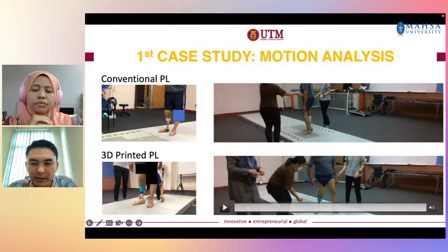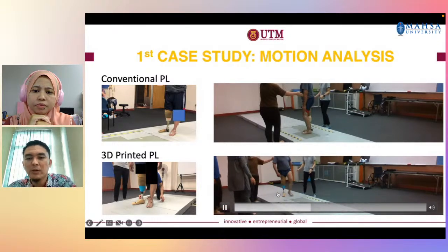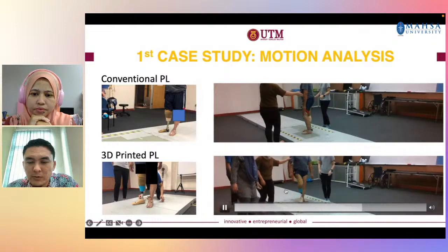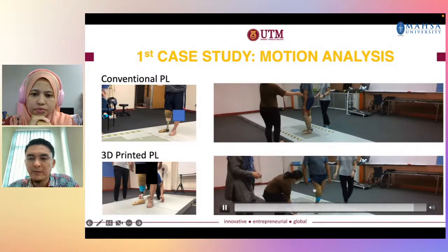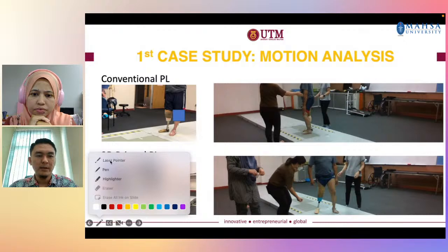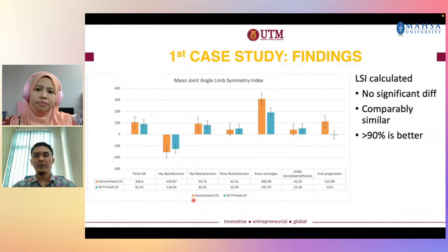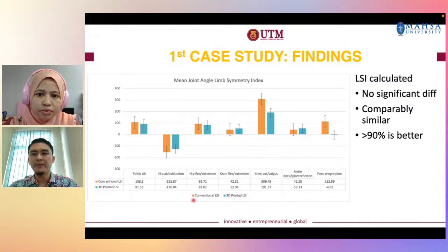Okay, so again, the patient steps on the force plate, to make sure that we get the forces to be analyzed. Okay, I move forward to the next one. Okay, this is what we found from the motion analysis study.